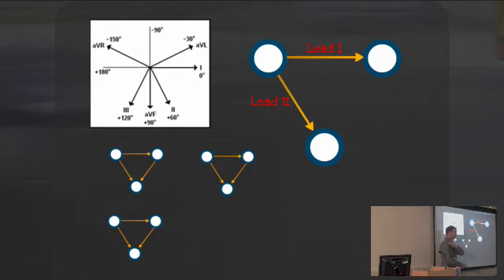For lead 2, we're still using the right shoulder as our negative electrode. But now we're taking the green lead, the medial malleolus of the left ankle, as the positive electrode. So we're looking at the electricity that's spreading that way. That's lead 2, and that's 60 degrees. That's why lead 2 is in that direction, because we're looking at the travel of electricity between those two.